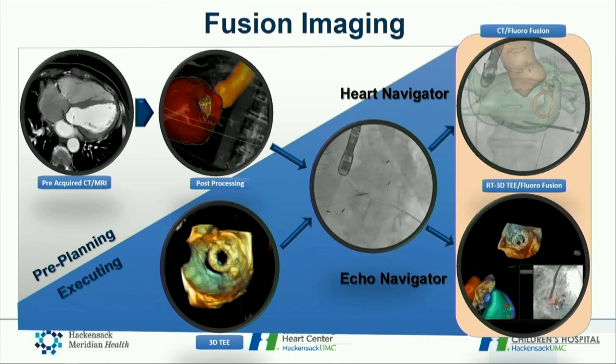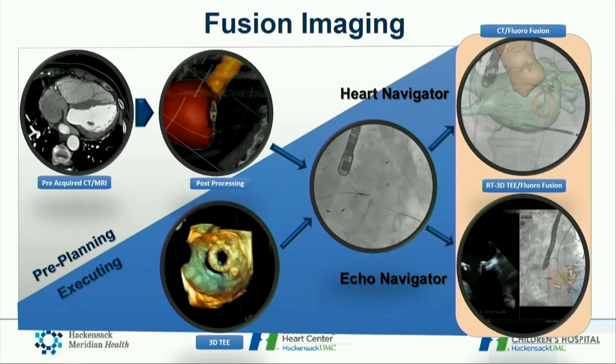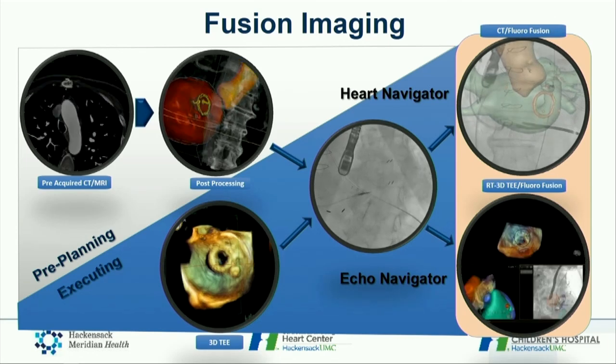As we're progressing towards mitral valve interventions, we're increasingly reliant on multiple imaging modalities. It applies not only to screening and diagnosis, but also to pre-procedural planning and procedural guidance as well.